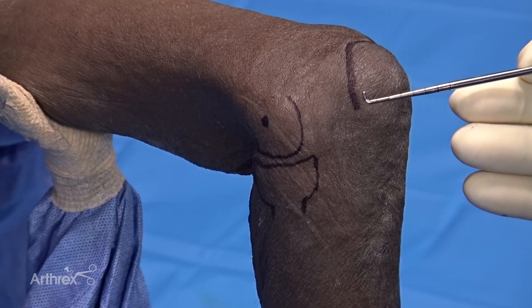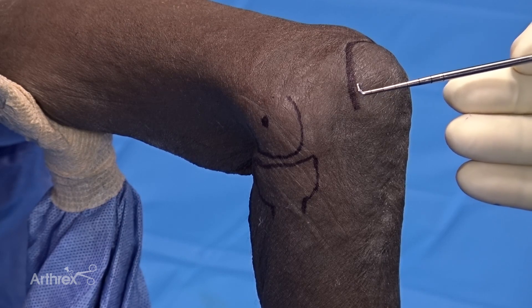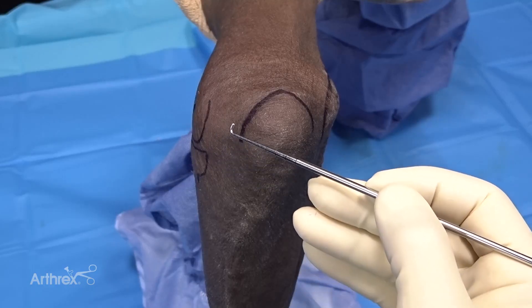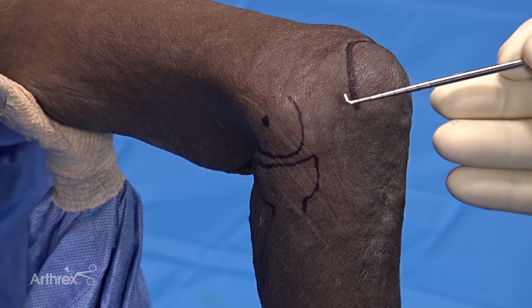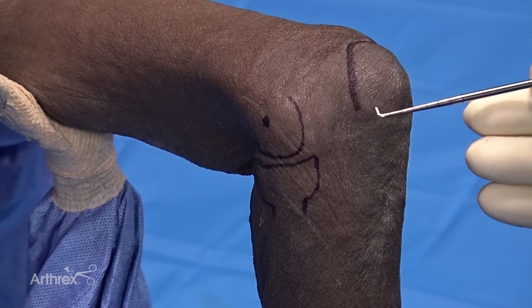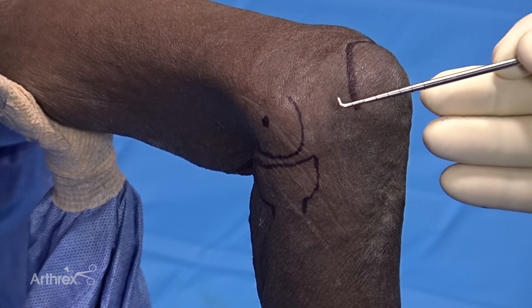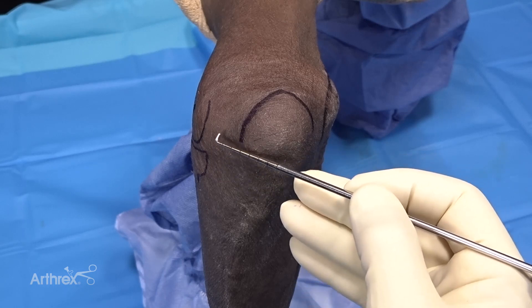The anconeus splitting approach is critical for graft insertion for the capitellum because it allows for a perpendicular approach to the articular surface of the capitellum. This is also a useful approach for fractures such as coronal shear fractures of the capitellum, as it allows for excellent visualization of the articular surface and perpendicular approach to place fixation.